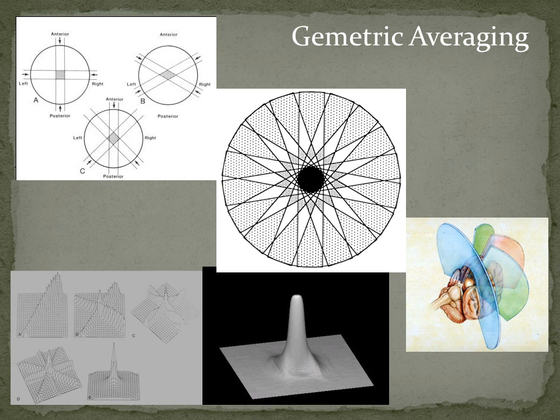If I continue this and I take 1 beam, 2 beams, 4 beams, 8 beams, 100 beams, what happens is this crisscrossing keeps on overlapping all of these beams on the target. I wind up with this kind of distribution which has this really high dose because of all these geometric overlappings, and then it falls off very rapidly because all of these beams diverge. It's pure geometry, nothing to do with physics. It's just pure geometry of beam averaging.